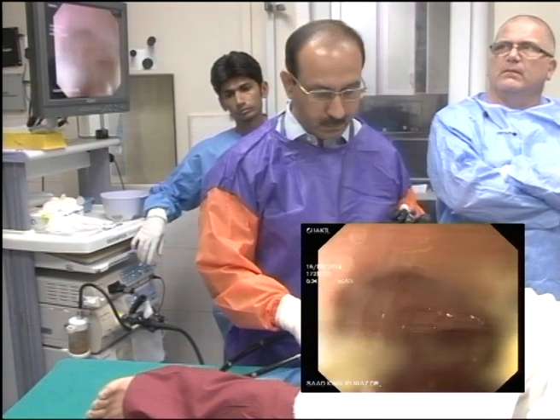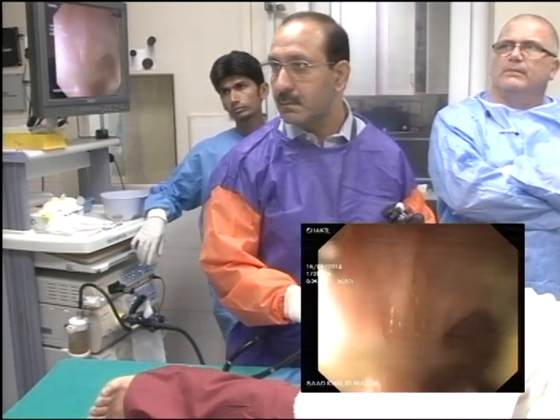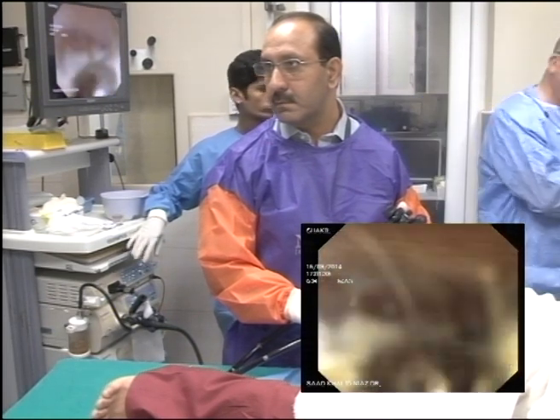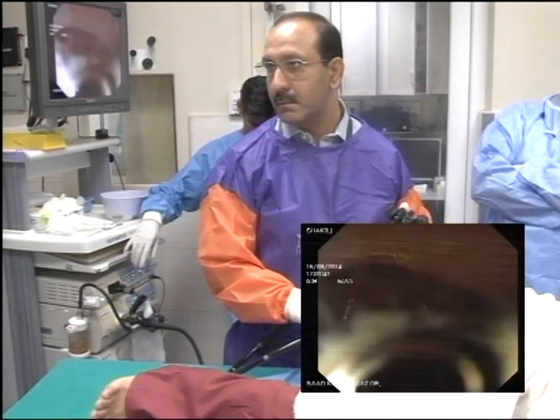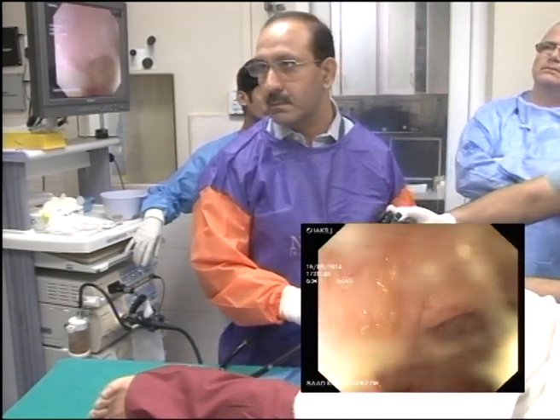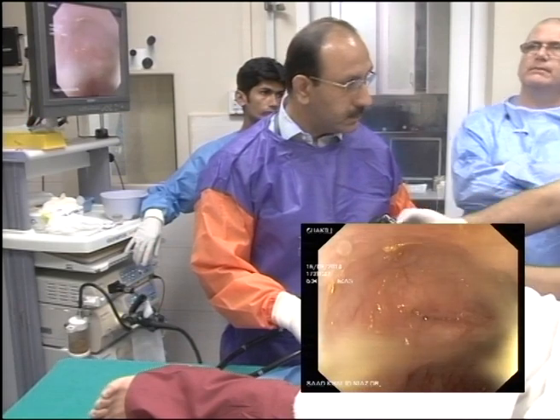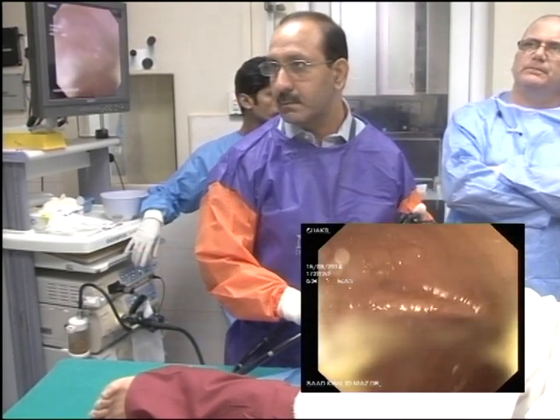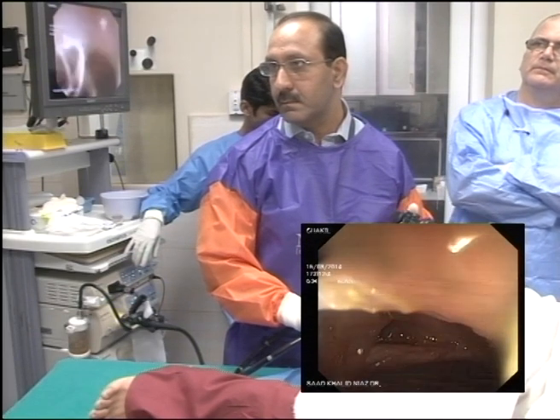My only problem is either I don't mention it in the report, which is fine, but if I choose to mention in the report that I saw this polyp, even if I take a photograph, I know there are many who would say no, we don't agree. The polyp has to be taken out, no matter who it is. So I think it's not the correct practice, but unfortunately that's how we work here.